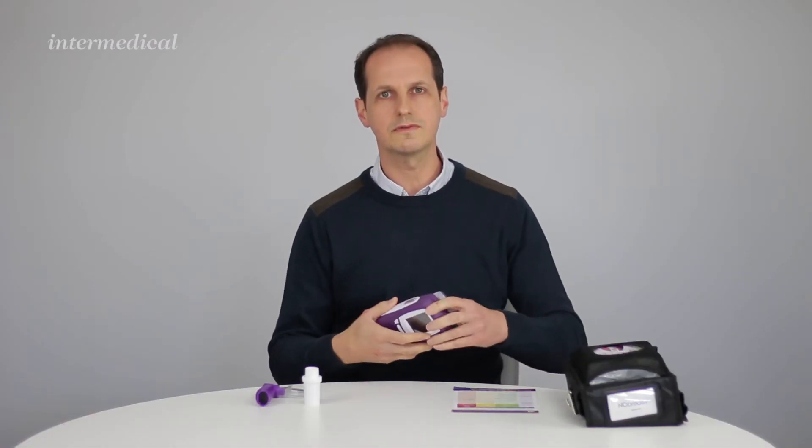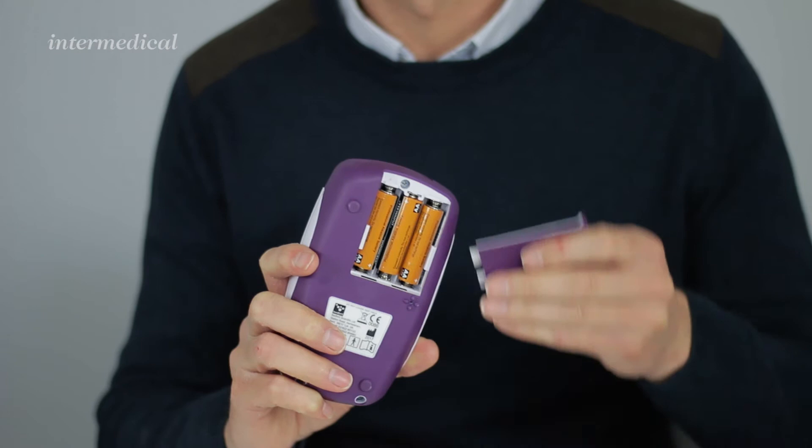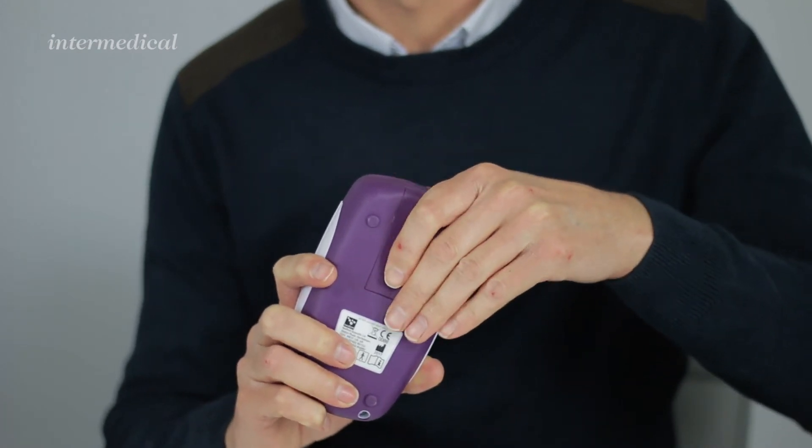The device runs off three AA batteries and the on/off key is on the top. When you switch it on you hear the pump start running, and the device will take 60 seconds to warm up.